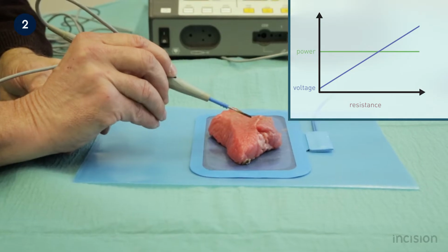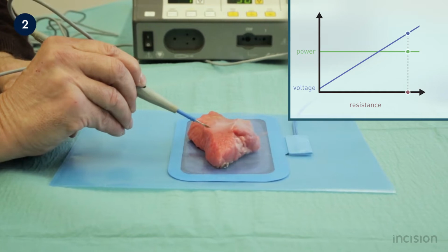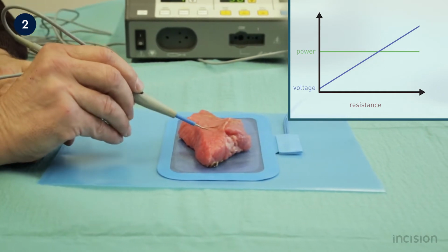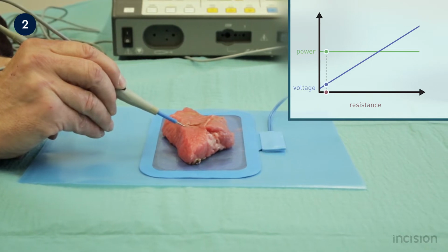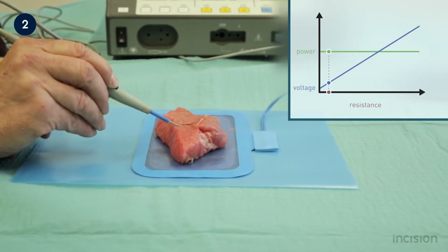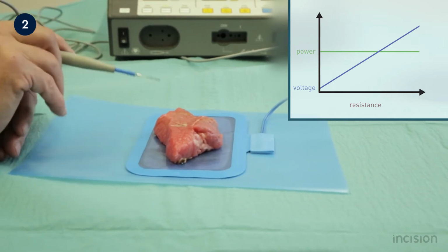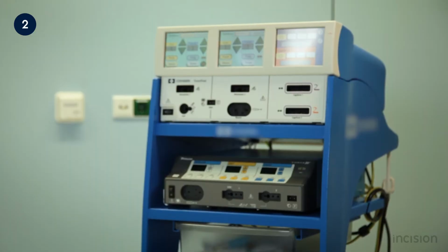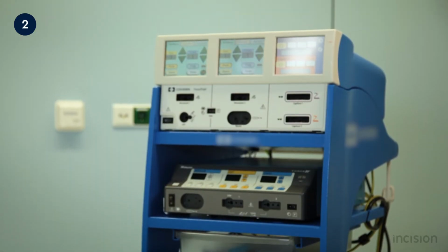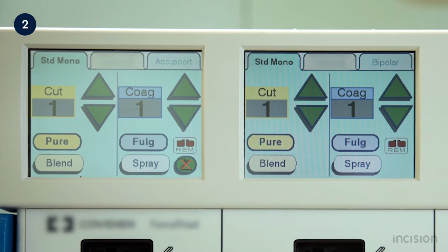This is shown here, again for both a high electrical resistance and low electrical resistance. If the voltage drops below 200 volt due to the low resistance, a cutting effect can no longer be obtained and coagulation will occur, resulting in hemostasis. The control method used by a generator may vary between different electrosurgical units and among the available modes of a specific unit.